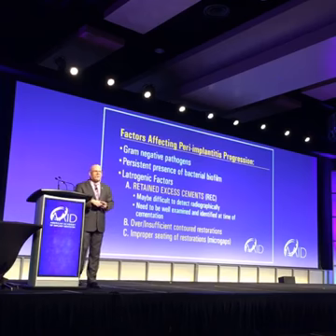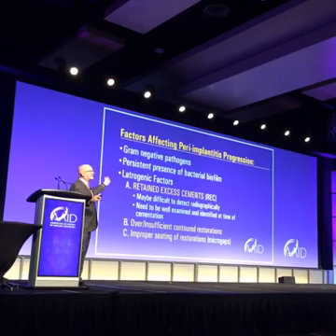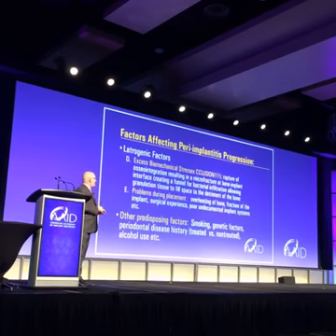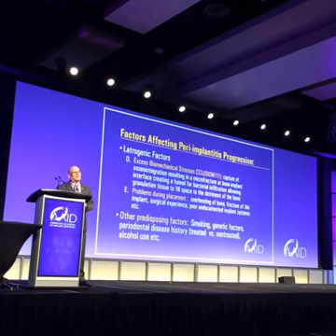In my practice, I've seen more of my referring dentists starting to do more screw-retained restorations now, right? I remember when implants were coming up, everything was screw-retained. Then it went to cementable, and now we're going back to screw-retained more because if you're going to have periimplantitis, let's eliminate one of the major factors, which is the excess cement. Restorations, over-contouring, insufficient contouring, improper seating, iatrogenic factors, and other predisposing factors. So again, all the things that really affect the periodontia also affect implants. And so there is a relationship between the two.